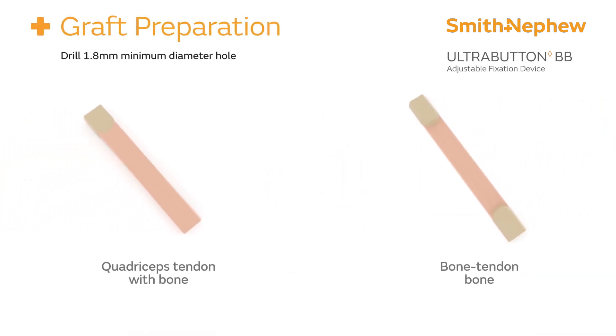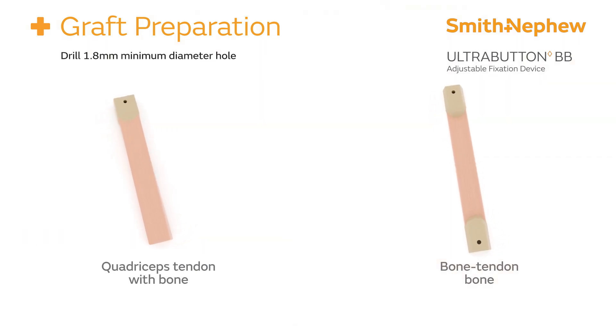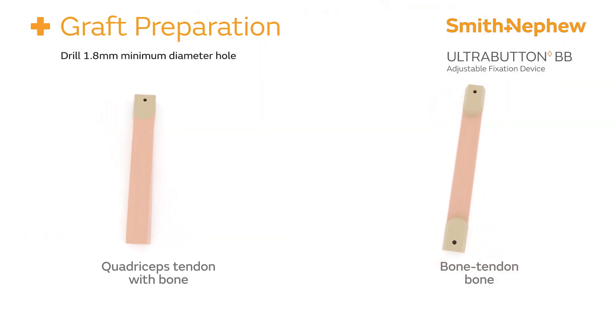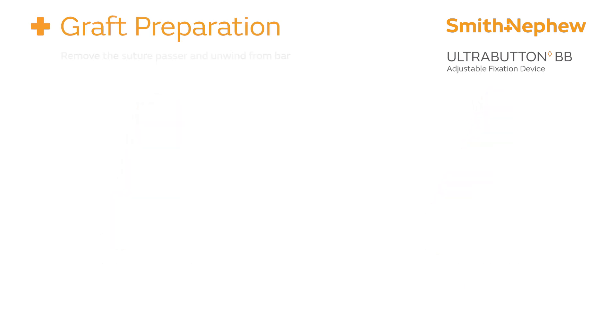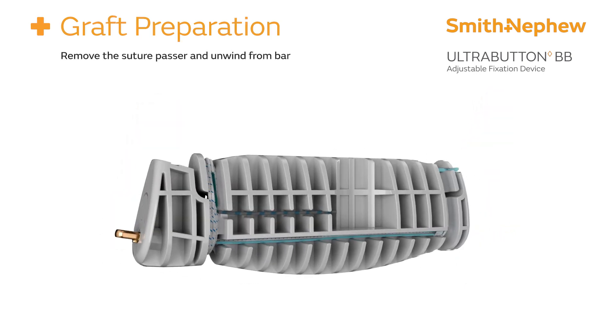Begin preparation by drilling a 1.8 millimeter or larger diameter hole through the bone block, ensuring it passes through the cortical layer. Proceed by removing the stiffening suture passer from the reduction bar and unwinding the attached sutures.